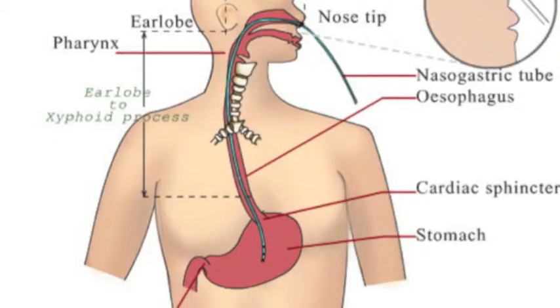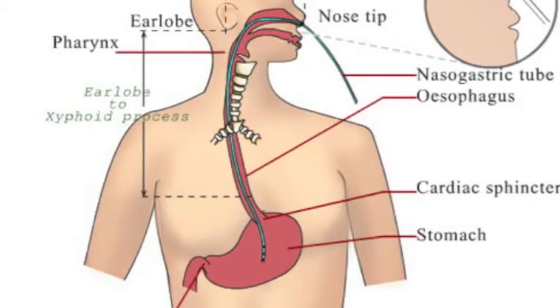Placement and placement verification. I knew that. Look. You gave me face. Okay, what does your book say?